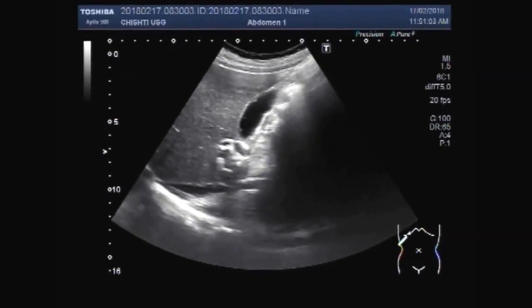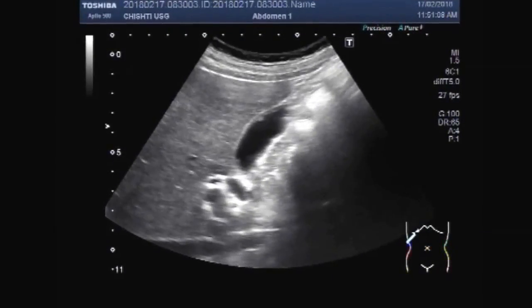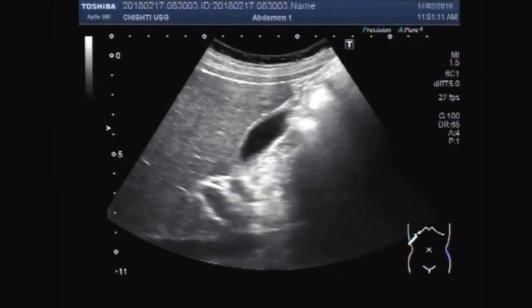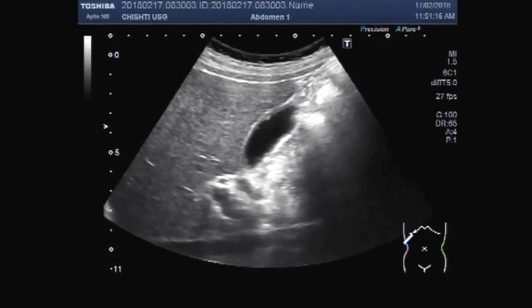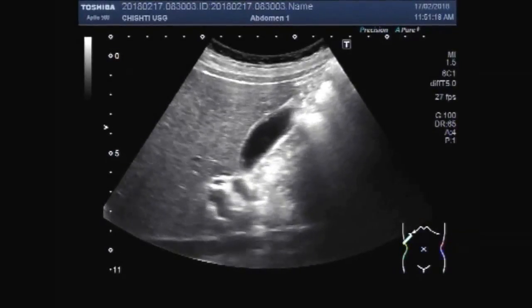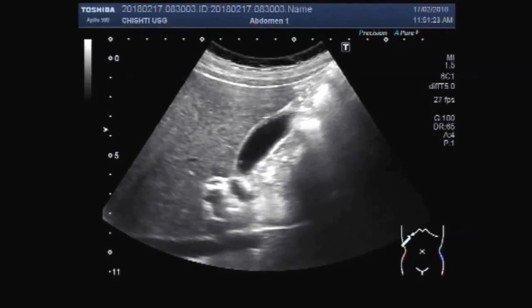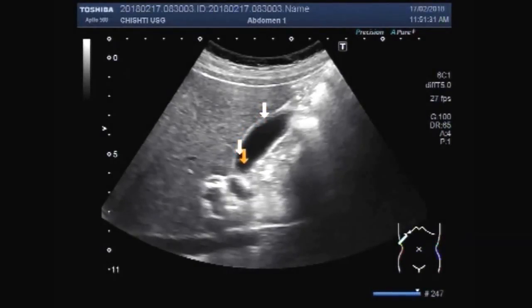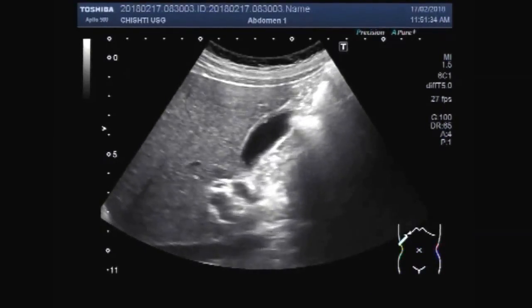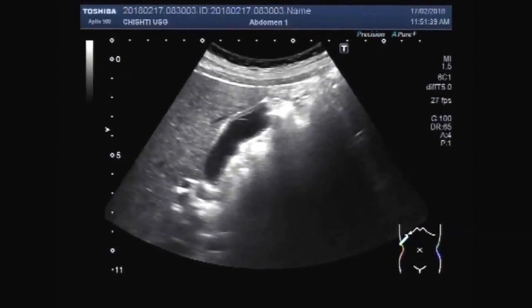There are multiple other small polyps. A small amount of thick sludge is also seen in the gallbladder. These are small polyps, and this one is a slightly larger polyp.